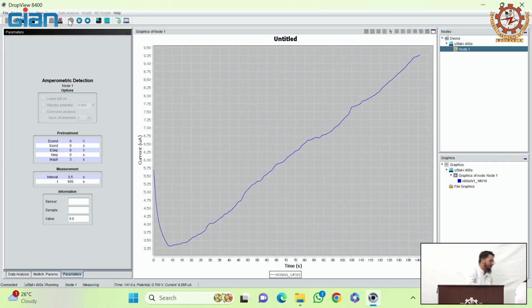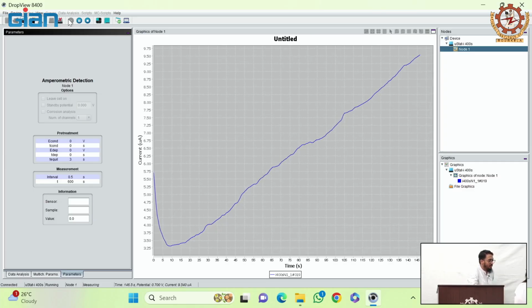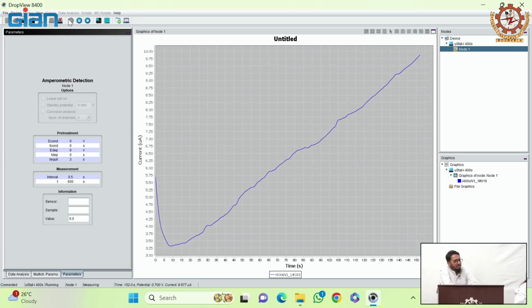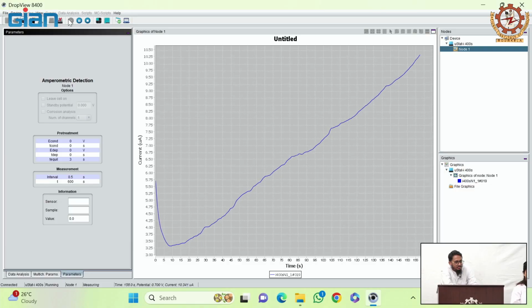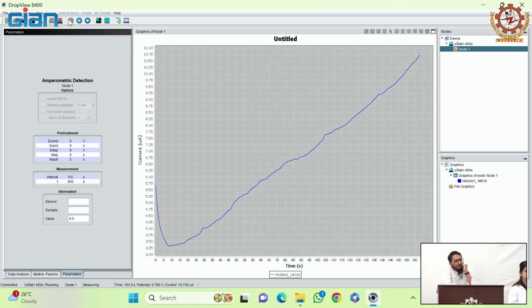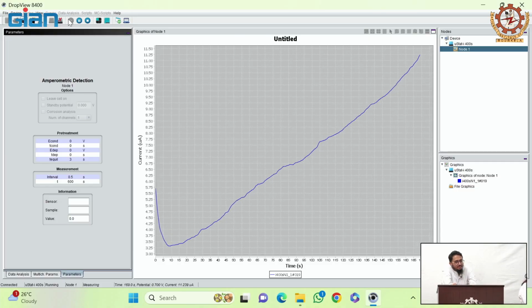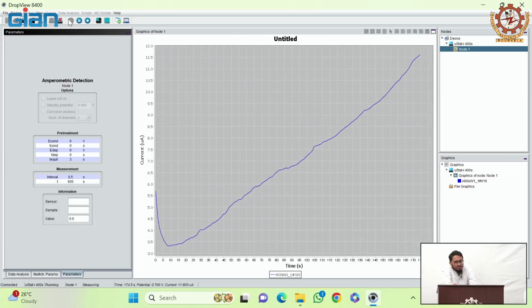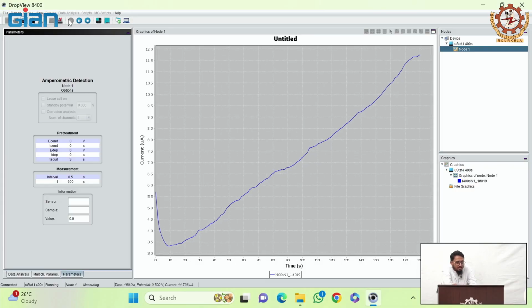In the meantime, we'll pass around some sensors if you want, maybe some CGM sensors. Those of you who have not seen the CGM sensor can have a look. There is the electronics, the PCB. You can see there is a small battery there. These sensors last up to 14 days in the body. These sensors also follow the enzymatic method.